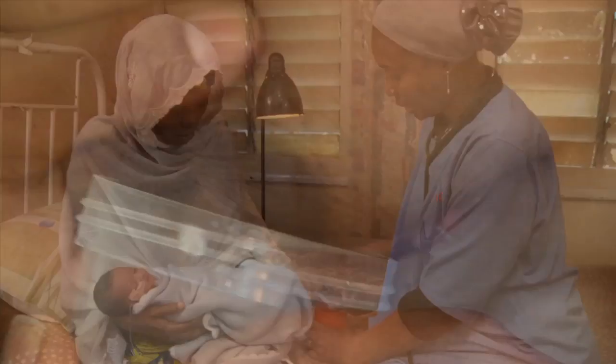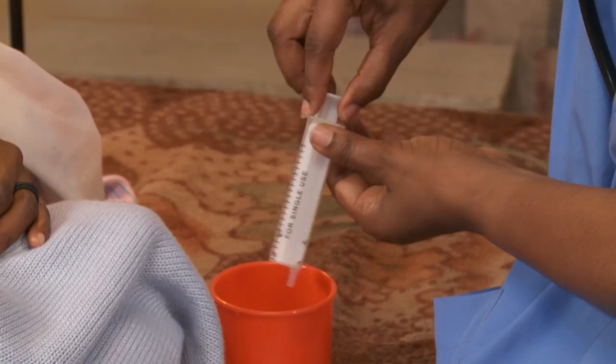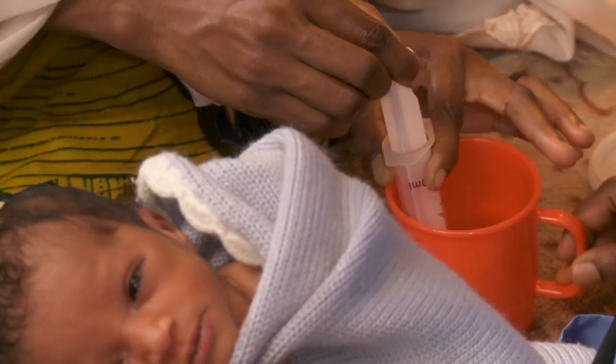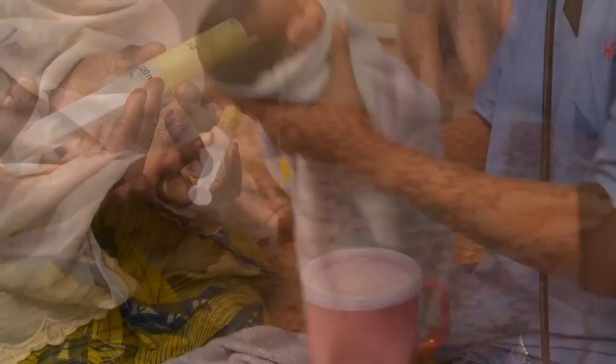Show her how to use the syringe to draw up the milk, and give her positive encouragement as she learns to feed her baby in this new way. Always check the location of the mark on the tube before each feed.